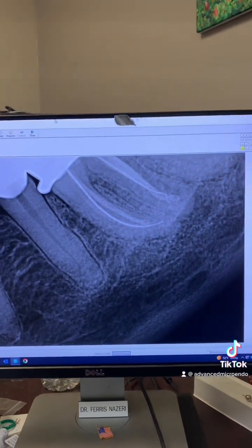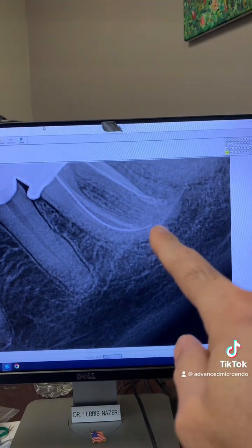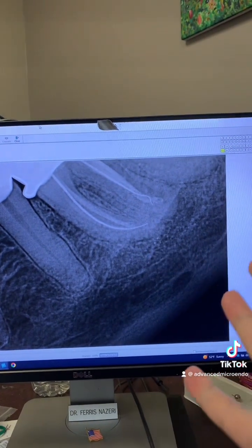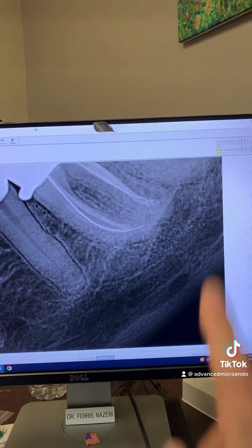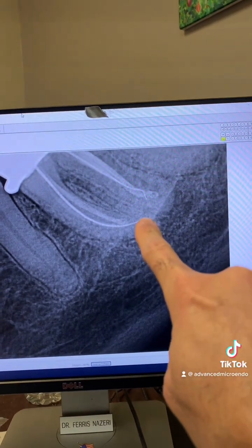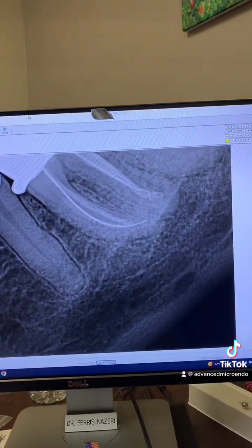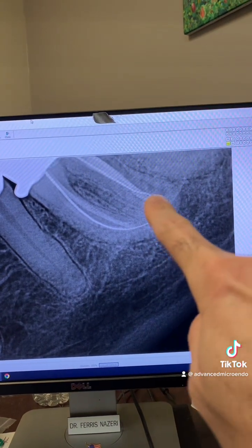This is my mid-op x-ray, just to make sure, because I went to 25 millimeters and I was still not getting any signal from my apex locator. So I took a PA to see where we were with this tooth, and as you can see, at 25 millimeters I was still short. Take a look at the curvature of the distal canal there.